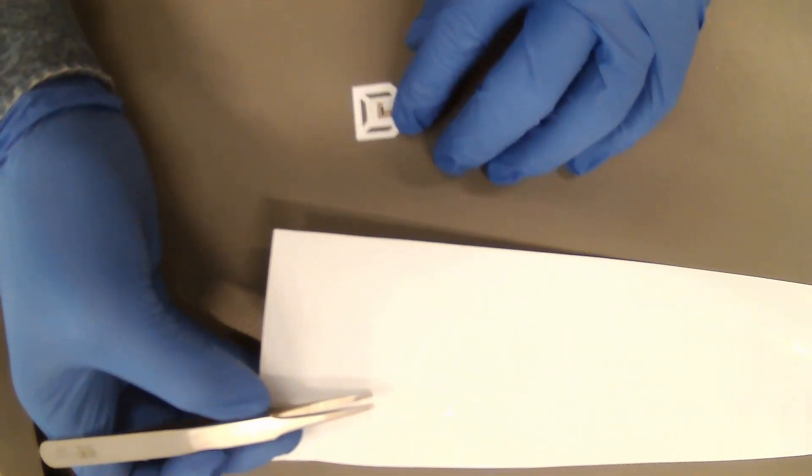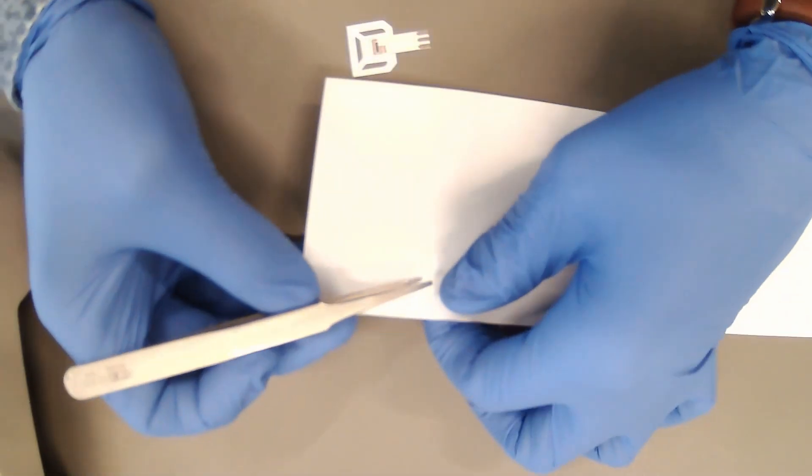In this step, you can see the adhesive layer being carefully peeled off, ready for attachment of the next layer.